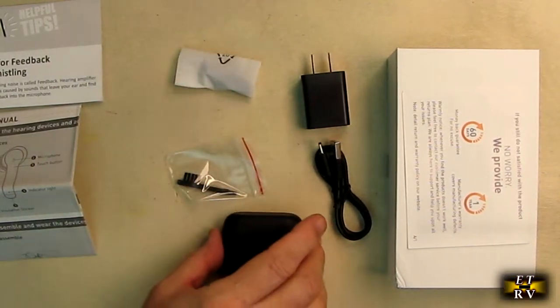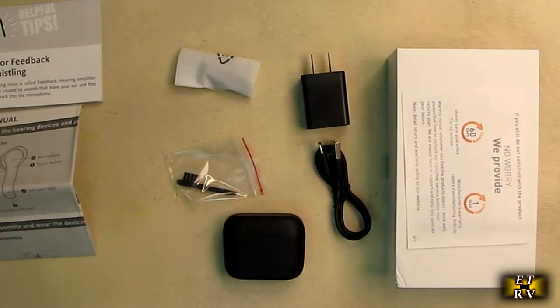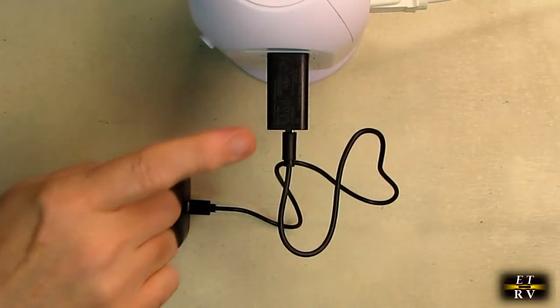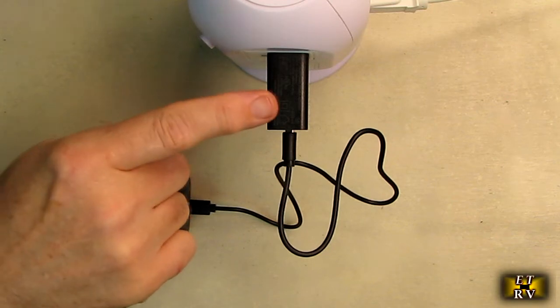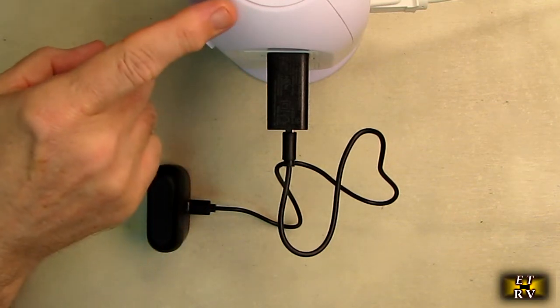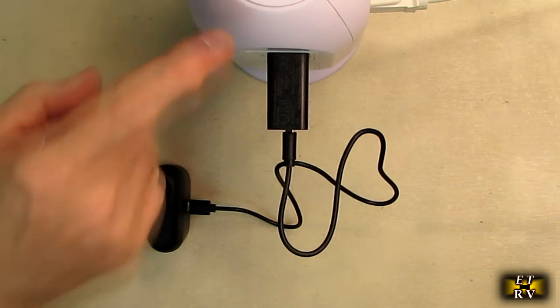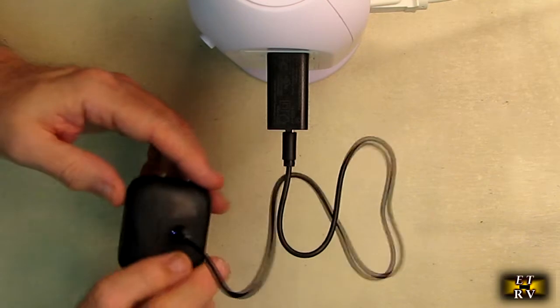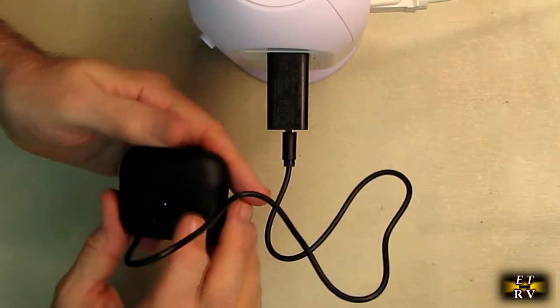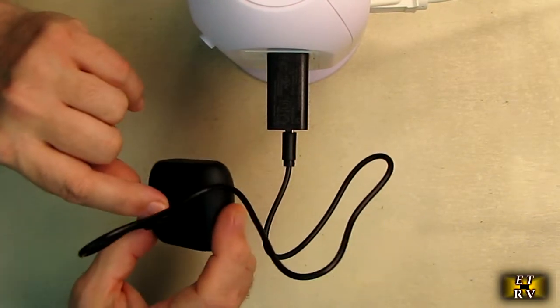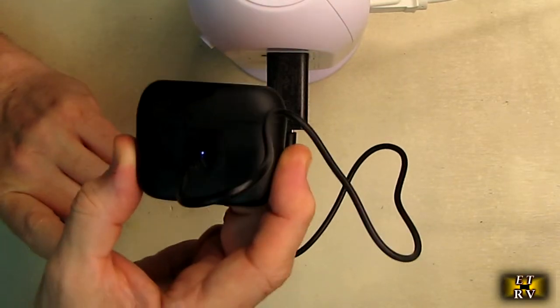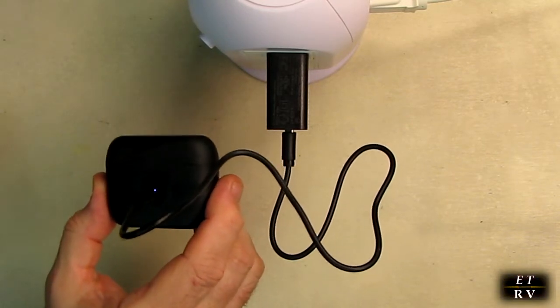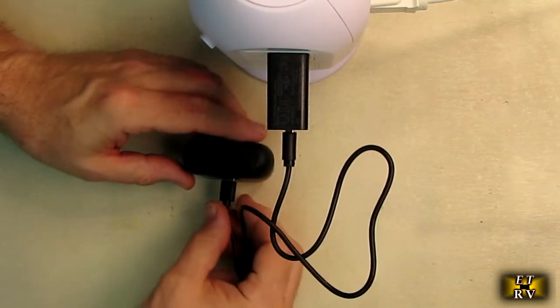To charge the hearing aids is really simple. Just take the included AC to DC adapter plugged into a 120-volt outlet, connect the USB-A, and it goes right into the back of the unit. There's a little LED that's kind of a purple color that should turn to green when it's fully charged.